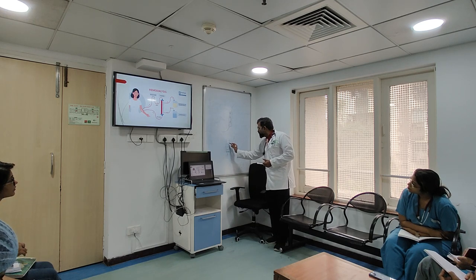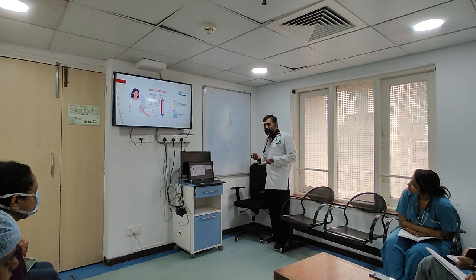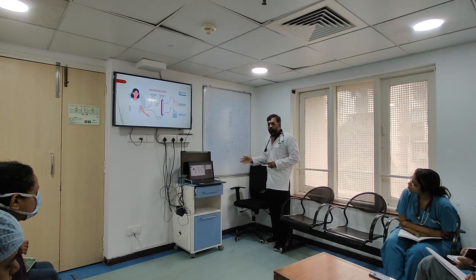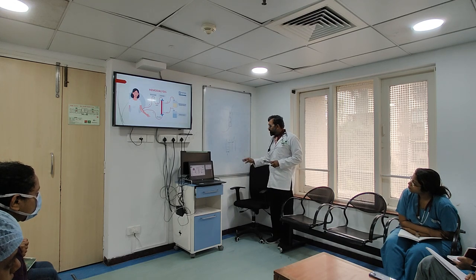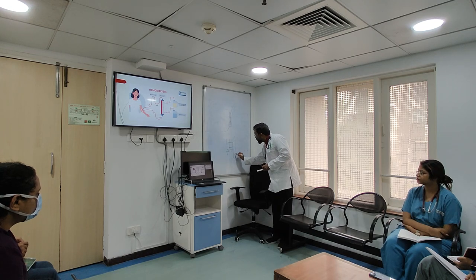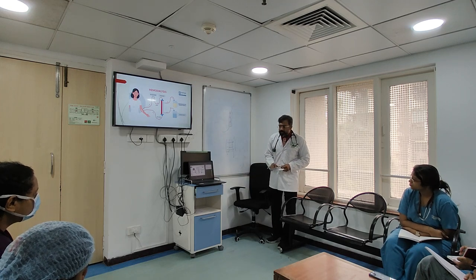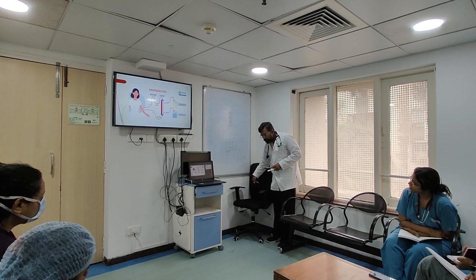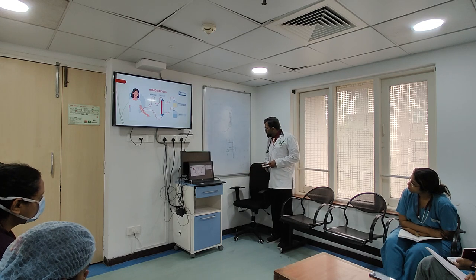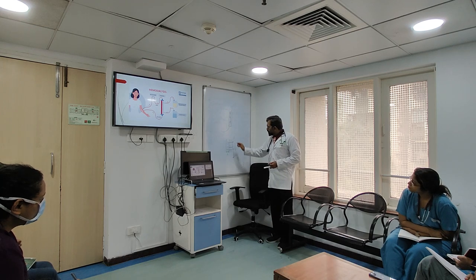Fresh dialysate comes, so the gradient is always going to be maintained. Even if I have two here and one here, the gradient is still maintained. So when you go counter current, more solute actually diffuses inside, because this is moving out. This is going in, this is moving out of the filter. Whatever it is carrying is moving out, and whatever is coming inside is completely fresh.